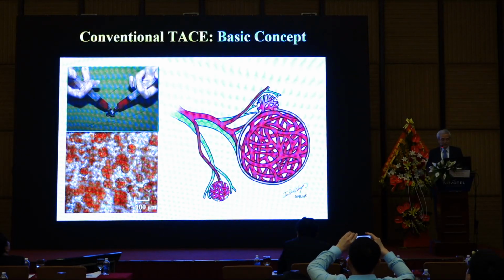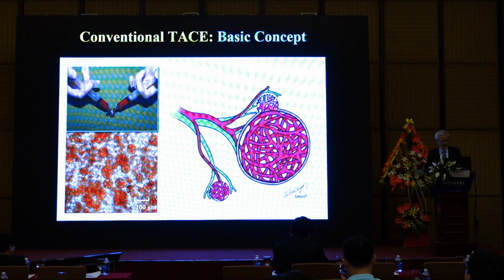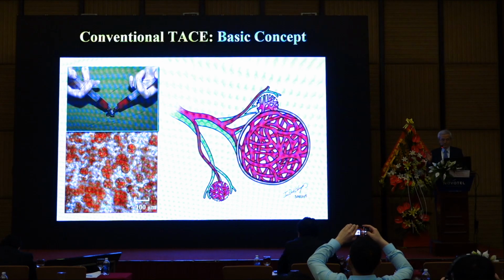I'd like to start with conventional TACE because it is very basic, and we usually mix the Lipiodol with anti-cancer drug dissolved in contrast media.